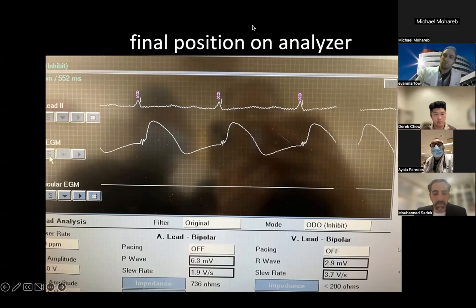And sometimes you kind of worry because you say, okay, now I'm sensing 5, and I have the current of injury of 30 or 40. But you don't care if it's still positive and you don't have an S wave and your impedance is above 500 or close to 500. Most of the time when you hook up the device, you're going to have quite nice sensing of 8, 9, 10.